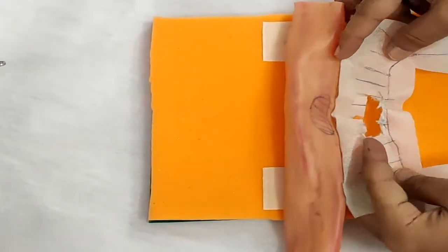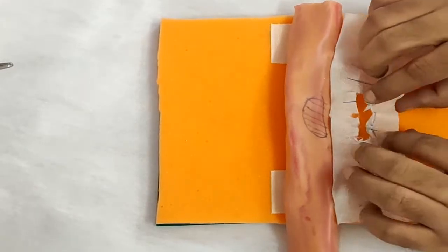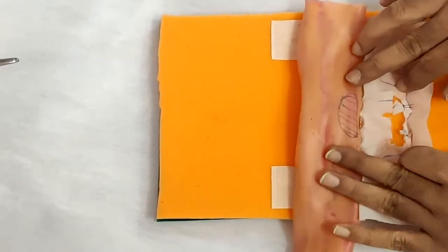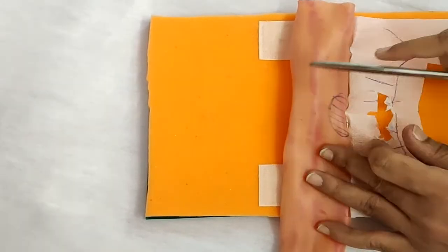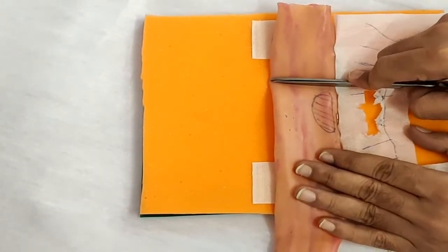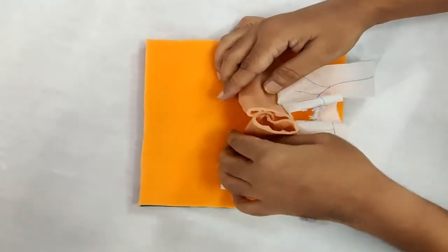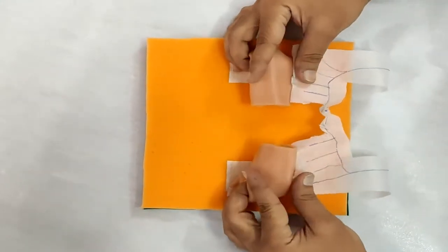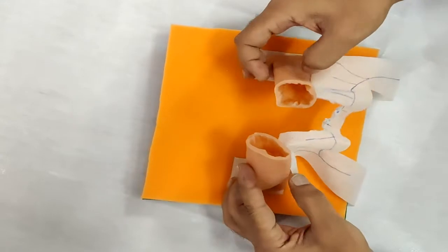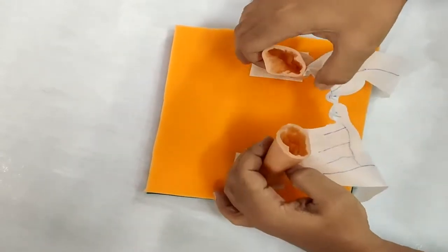So we have devascularized this segment of the bowel and now we can cut the diseased segment of the bowel. So here we have cut the segment of the bowel. There is a defect in the continuity of the bowel and defect in the mesentery.